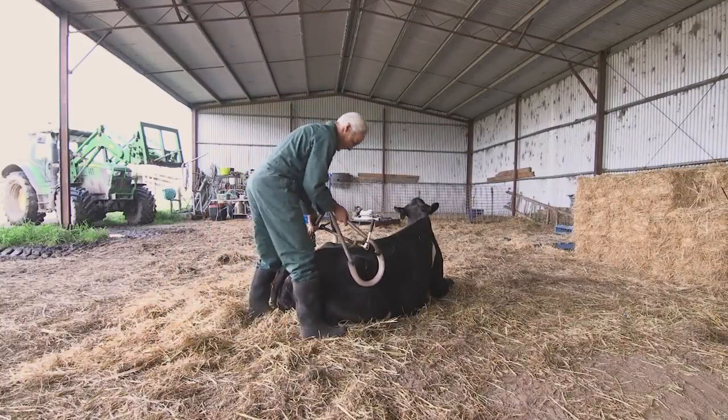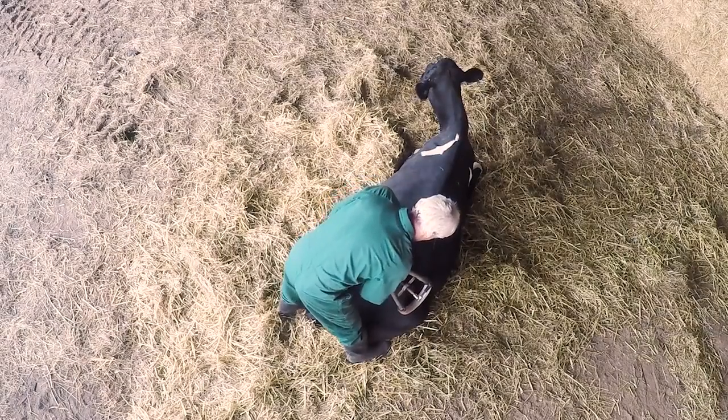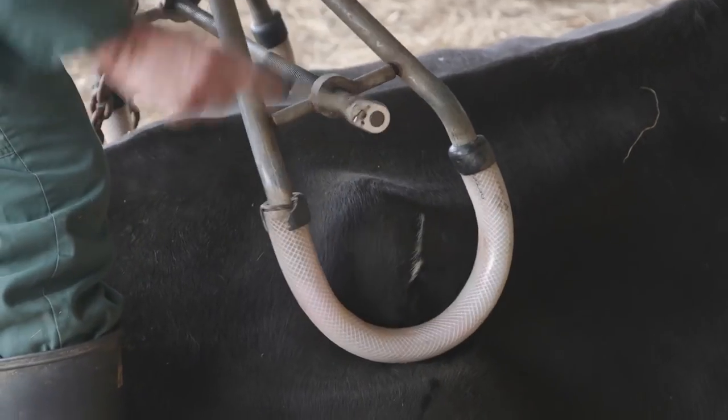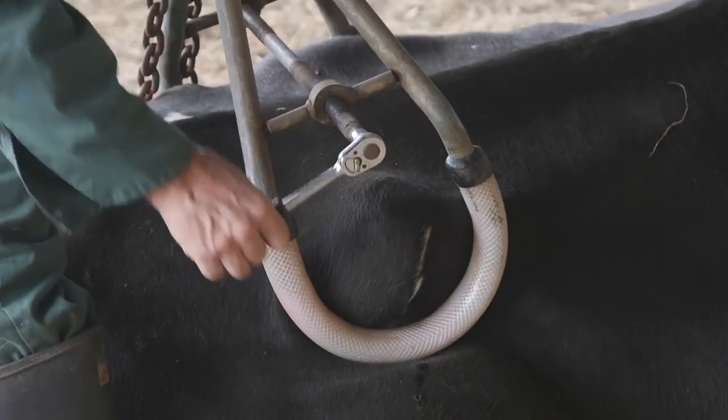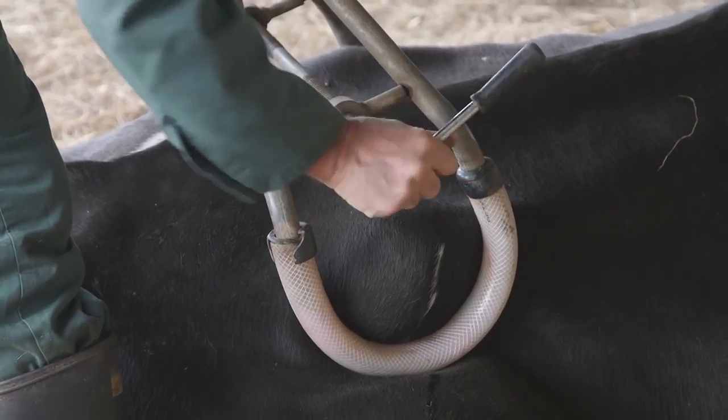Approach the cow from behind and apply the hip clamp to the wings of the pelvis. It needs to be done up firmly so that the cow doesn't slip out and cause damage to the pelvis. Ideally the hip clamp will be padded to also provide extra protection to the cow.